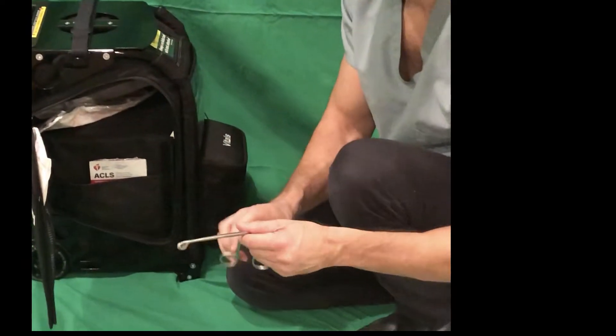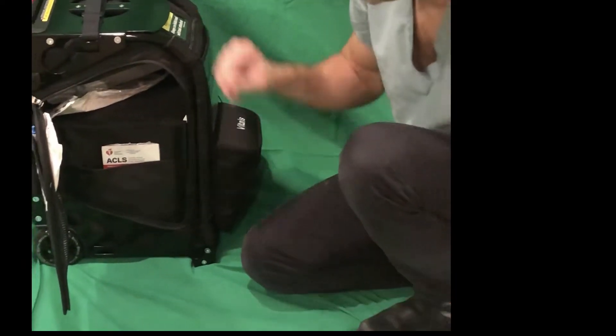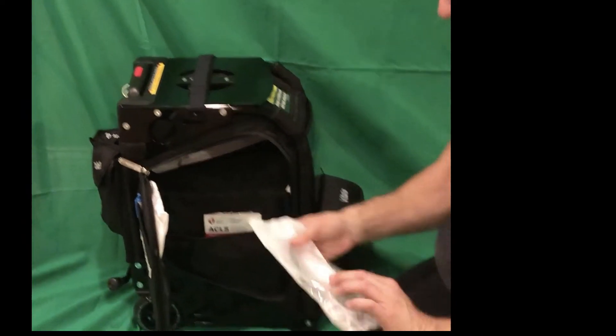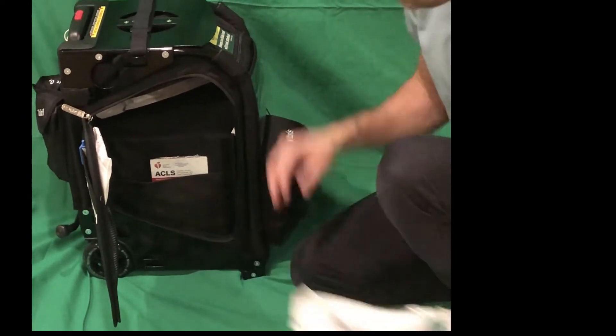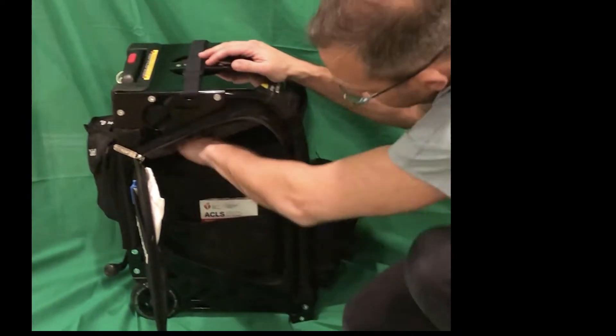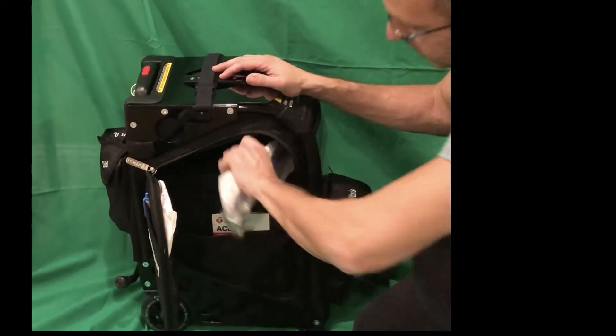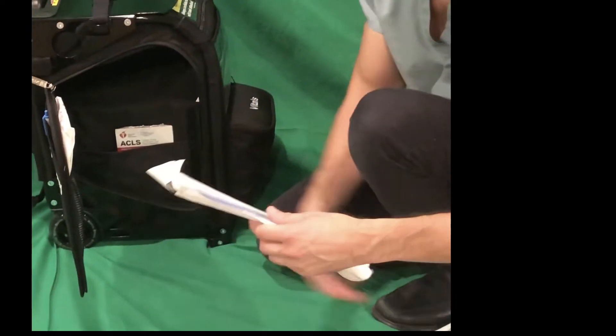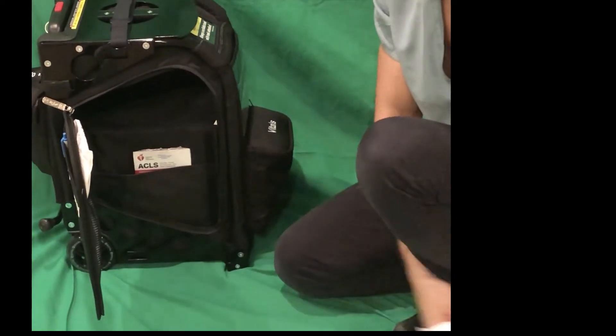We also have McGill's forceps to help if we were actually intubating, different size blades for intubation, and finally a Yankauer suction if we need suction.